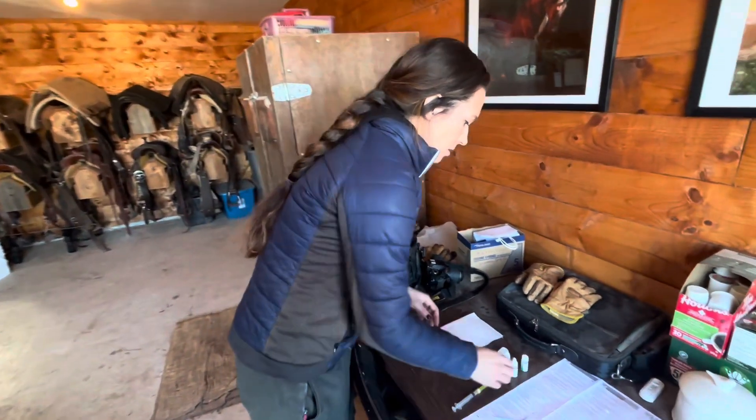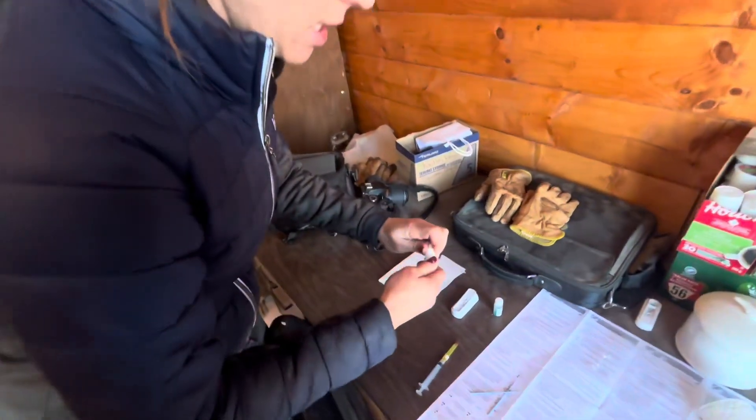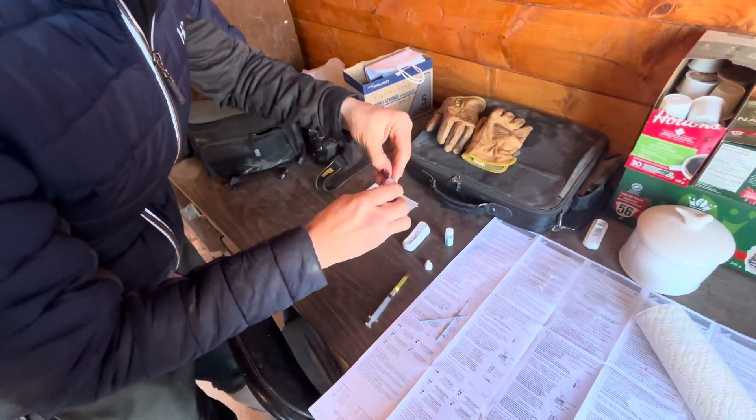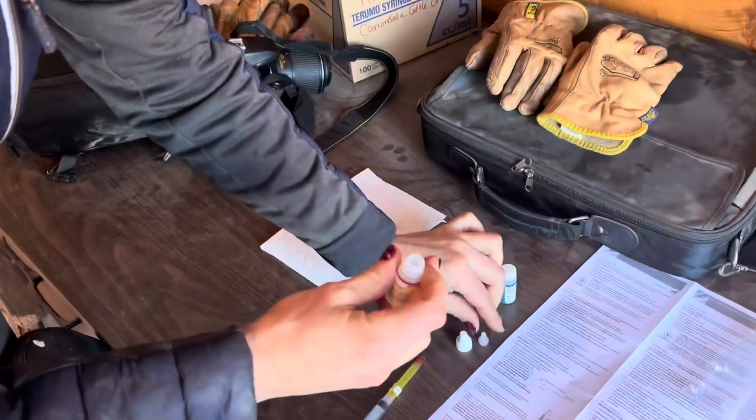So we're gonna get started. We're going to first take the lid and the dropper top off of the diluent bottle.